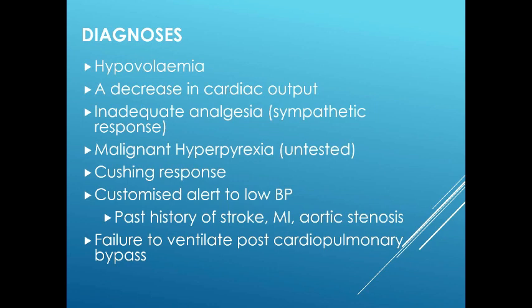The Cushing response, reflecting my past practice in neuroanesthesia, has a short time window for detection because it is an acute response. It is uncommon, and the standard monitor should pick up the changes if the alarm settings are appropriate for bradycardia and hypertension.